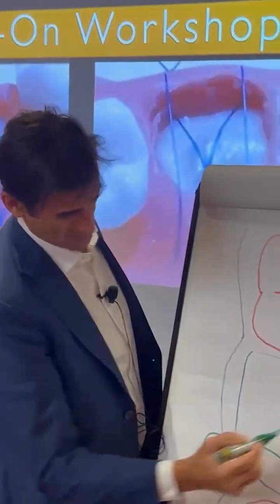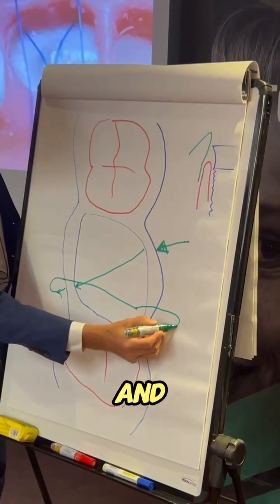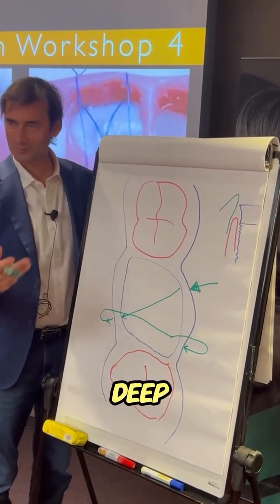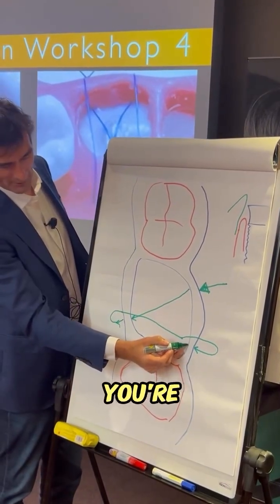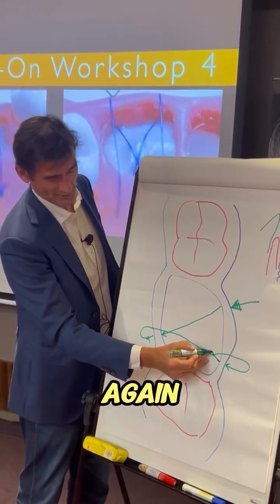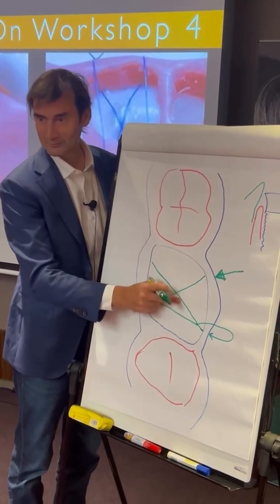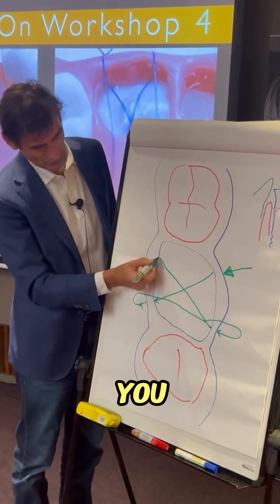You go out and then come back in here at the bottom again — don't grab the membrane, just take a deep bite of that. Then you come on top of the membrane again, come out here, and go across again over the membrane. So this suture is going to be right on top of the membrane, and this suture is going to be right on top of the gingival crest.